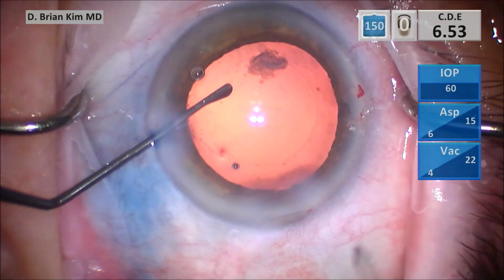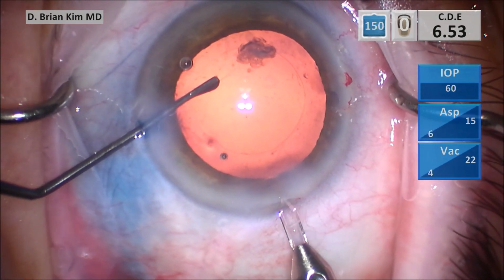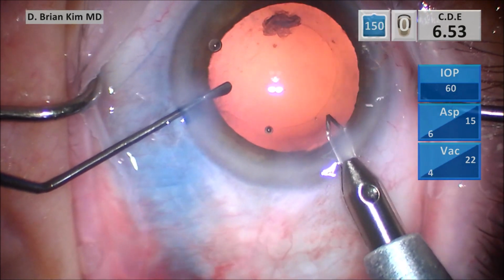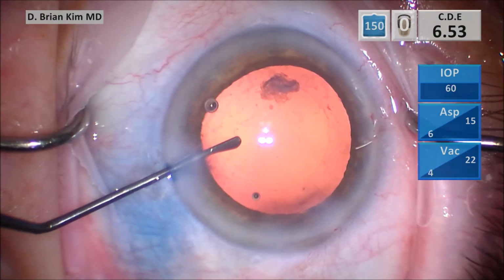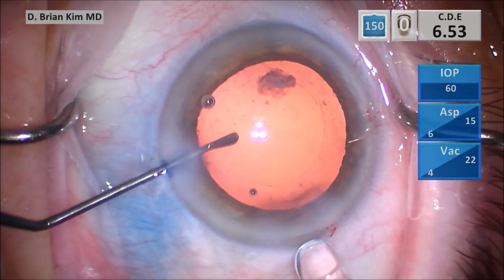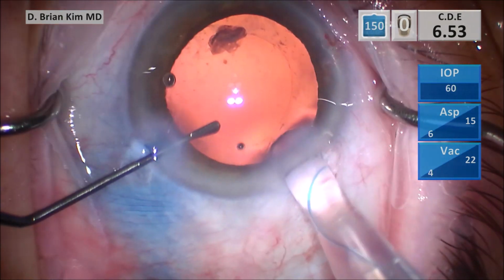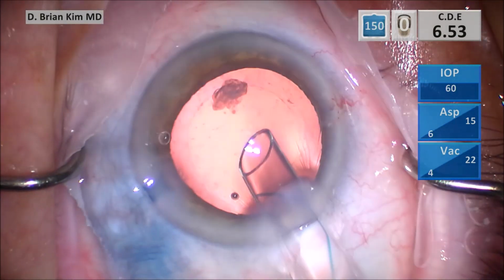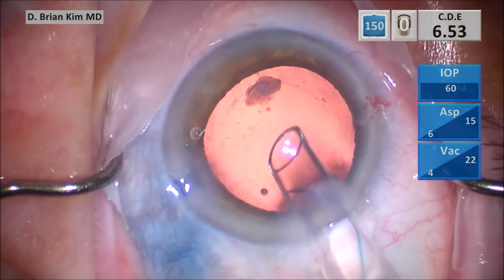Again, with these very dense lenses, I do worry about zonulopathy, so I tend to go with a 3-piece lens. So I'm extending the wound with my diamond blade, and then I'm going in with the 3-piece lens, have the bevel pointed towards the left. As I deliver the leading haptic, it comes out planar.